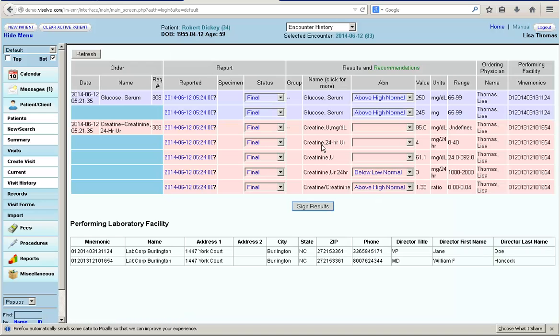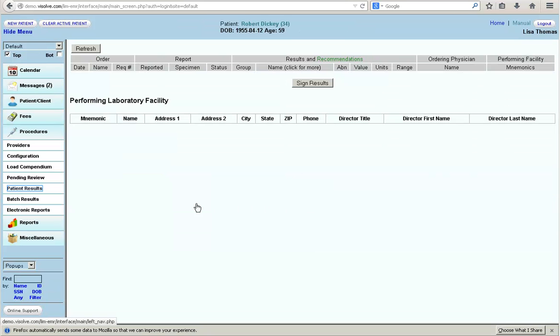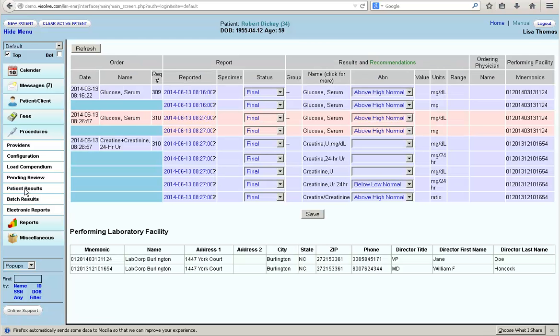Dr. Lisa signs the results by clicking on Sign Results button. Now the result is placed in the Patient Results section. Dr. Lisa is happy, as she can place her orders and receive results in a single click, and the rest is taken care by vSolve's Lab Interoperability Module.